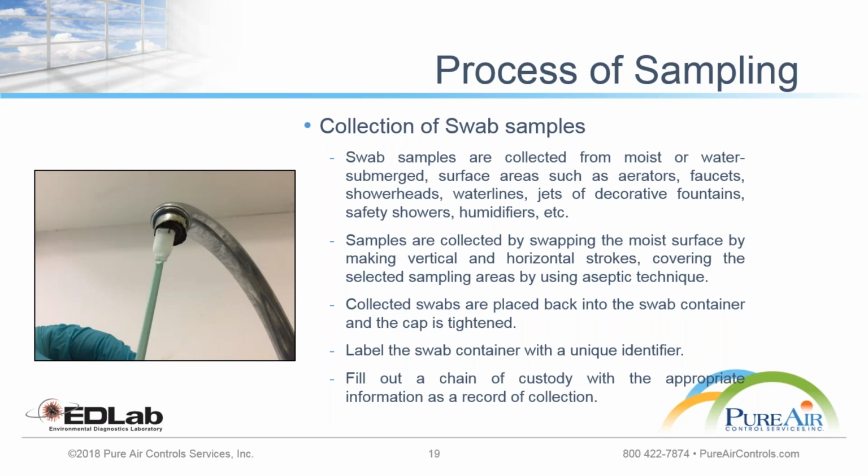The swab sample is lifted, and then it is moistened with a drop of sterile water, and then it should be placed back in the container using the aseptic method. It is then identified with a unique identifier and sent to the laboratory for further processing.